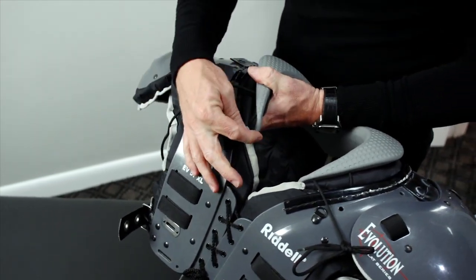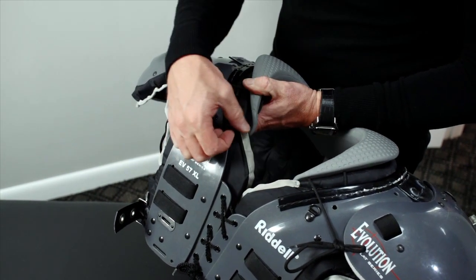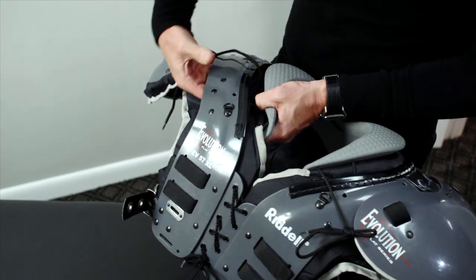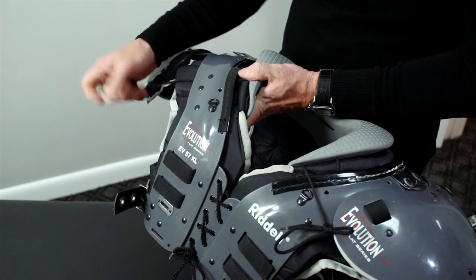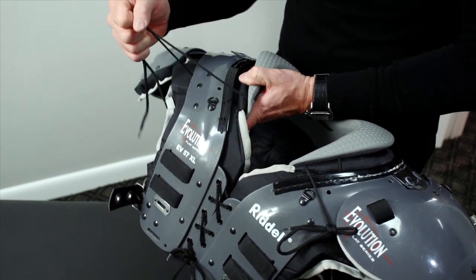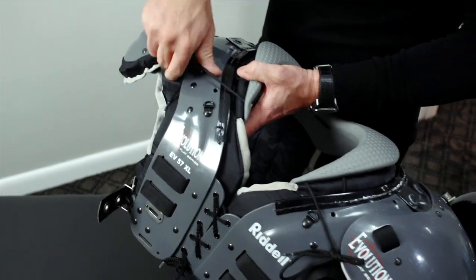We want to make sure the front of the Kerr collar is hitting this part of the shoulder pads. The top string will go under the hard piece of plastic of the shoulder pads. The bottom string will come across, so that is how it is supposed to look. And we will tie it.